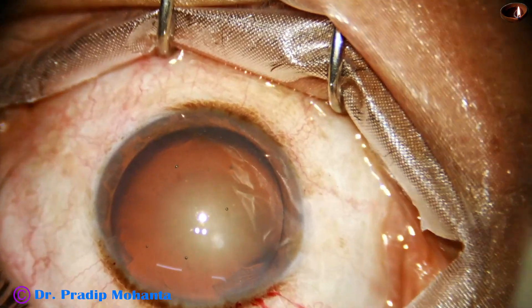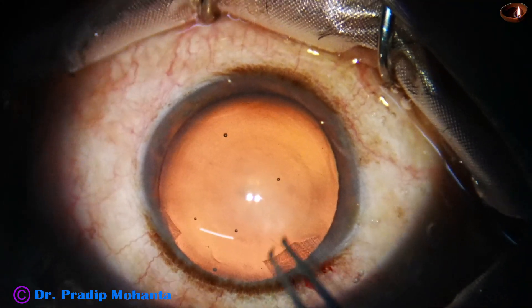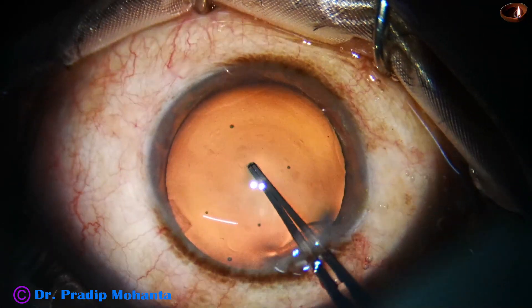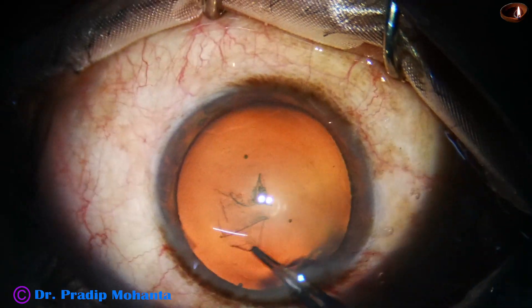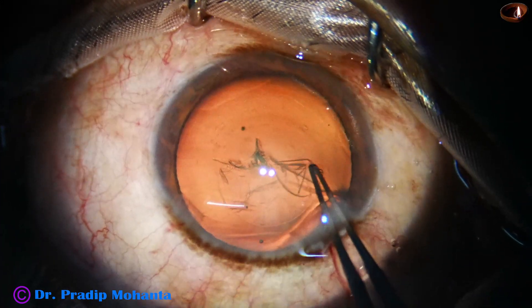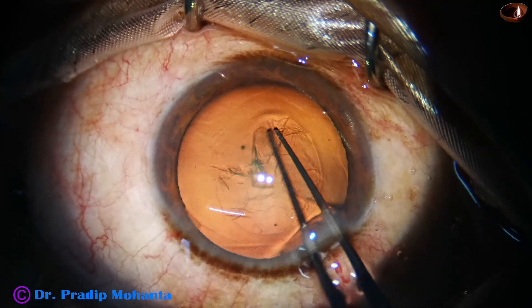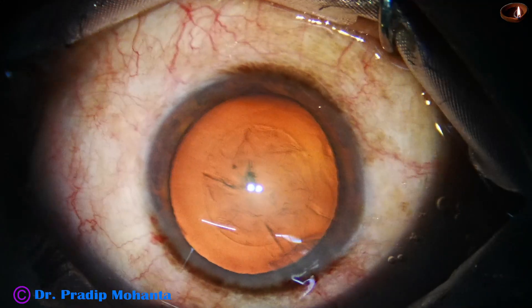Capsulorhexis is done with the help of utrata forceps. This is a stereo coaxial illumination and we get a very good red glow. The microscope is Lumera T from Zeiss. The size of this rhexis is about 5 mm.